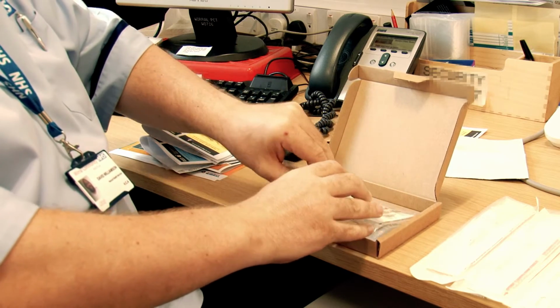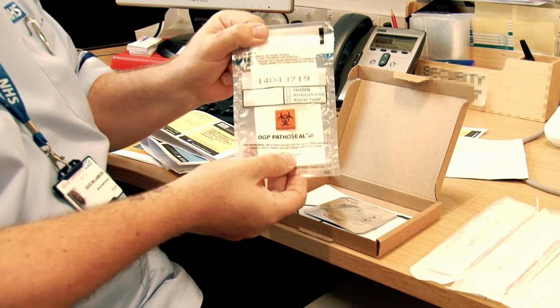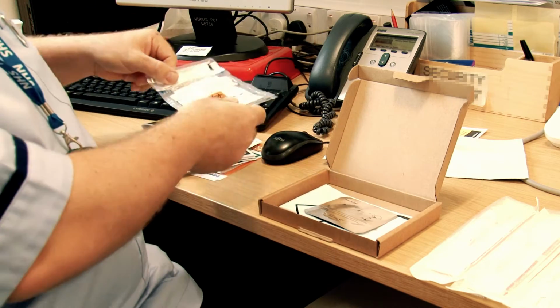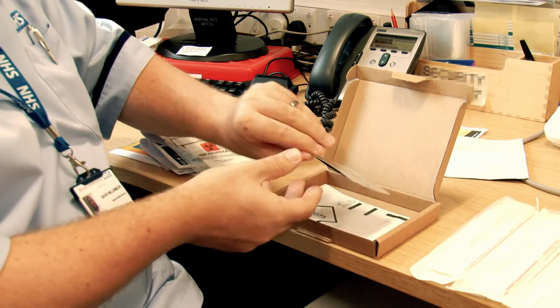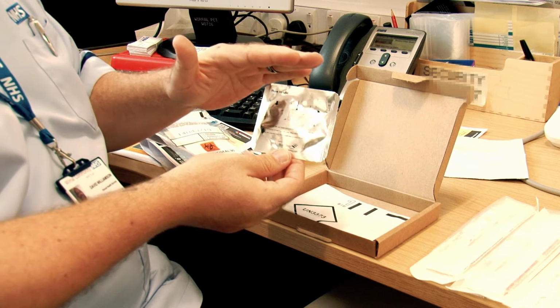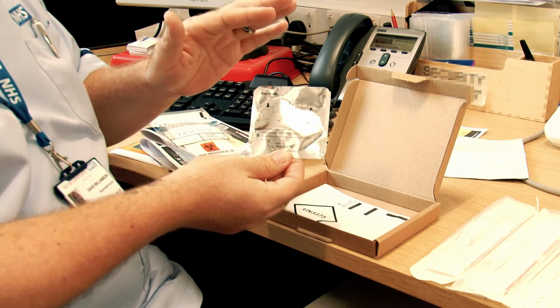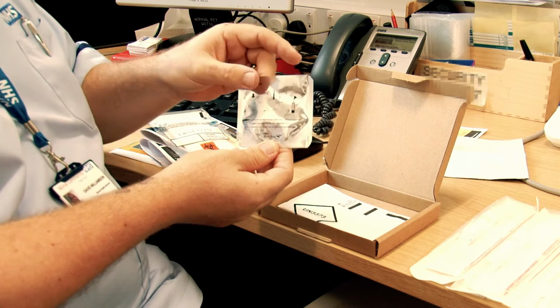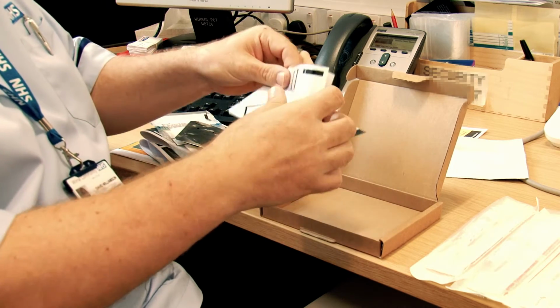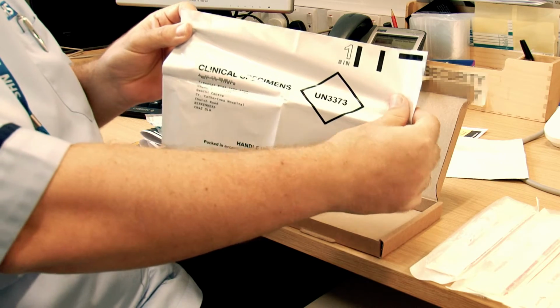You'll have this little pack in here, which has got absorbent material, and your test goes in there in case it would leak in the post. I'll talk to you a bit more about that later. This is a foil pouch, and this would be what you would urinate in if you ordered the urine test. So men would get this, definitely, and some women would get this. And this is the envelope you would send it back in. It's prepaid and pre-addressed.